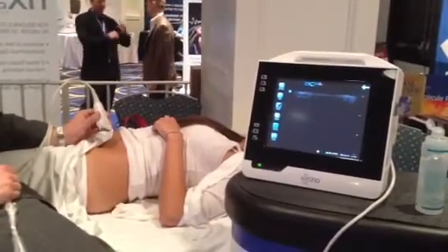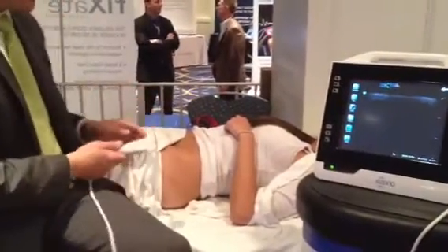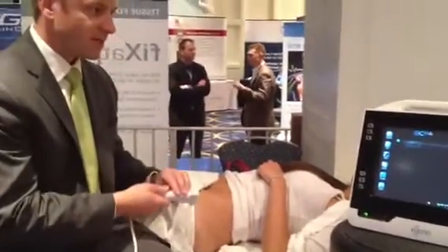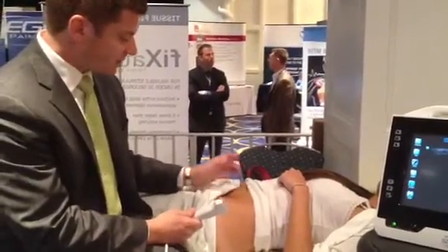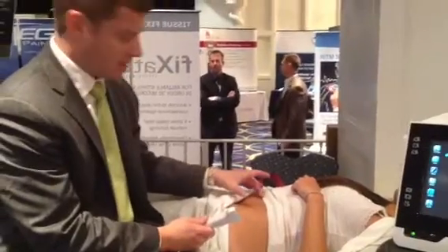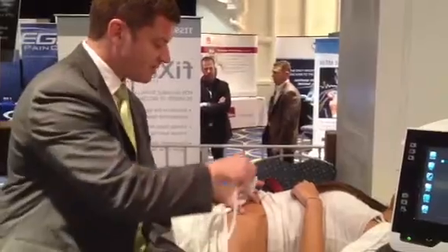What I want to do first is identify the ASIS and get the right angle. Angle is extremely important for this procedure. The ASIS — what I want to do is angle the probe towards the patient's belly button. ASIS and the belly button — that's going to be my angle.